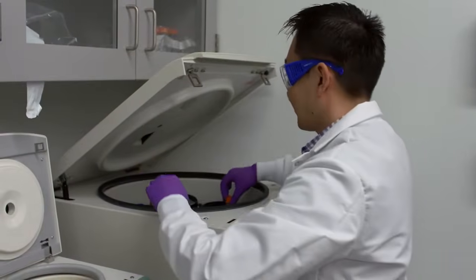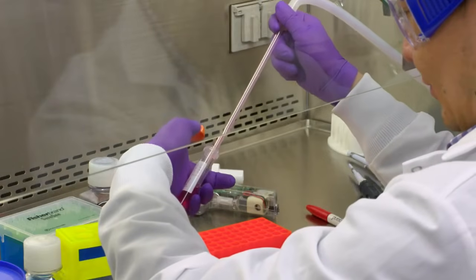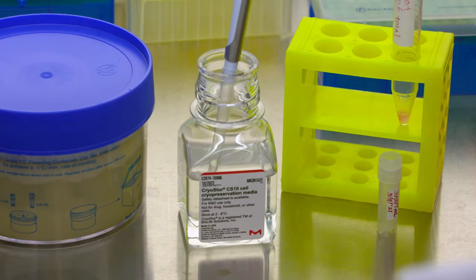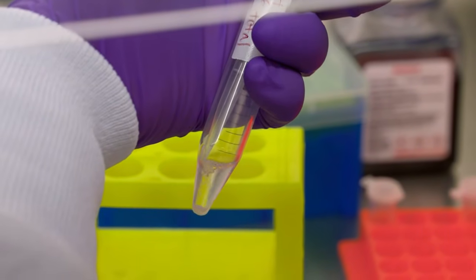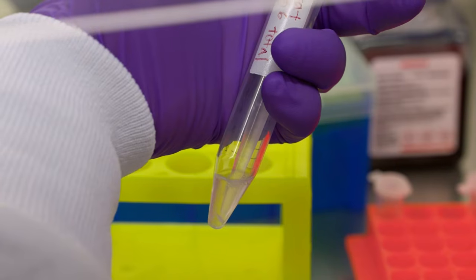Pellet cells by centrifugation. Carefully aspirate media without disturbing the pellet. Gently but thoroughly resuspend the pellet in an appropriate volume of chilled freezing media and transfer 1 ml aliquots to pre-labeled cryovials.